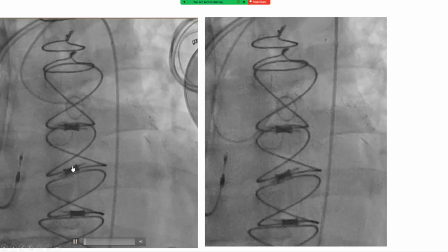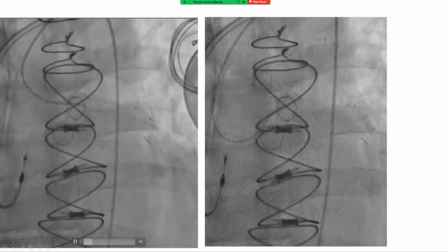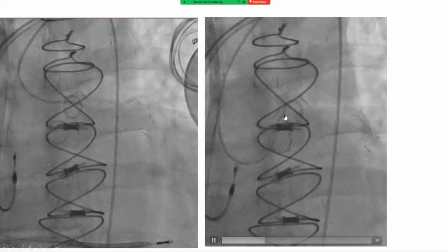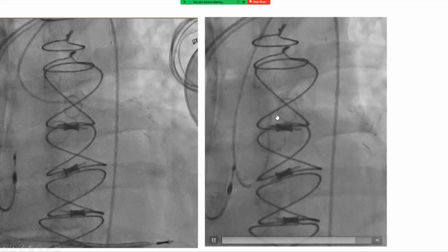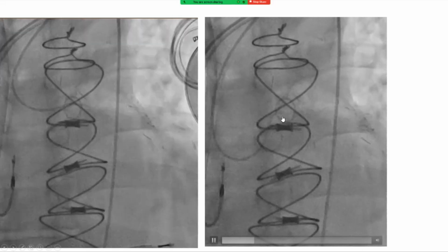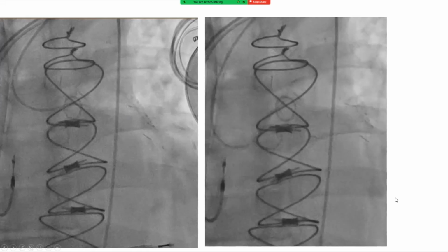This is an illustration of a case where pulling on the catheter made it dive deep. So the way we maneuvered it is actually by pushing it to prolapse it, then torque it out. This is a case of Amplatz left in a vein graft. So again, push, it prolapses a little bit out, then you fully torque it out.